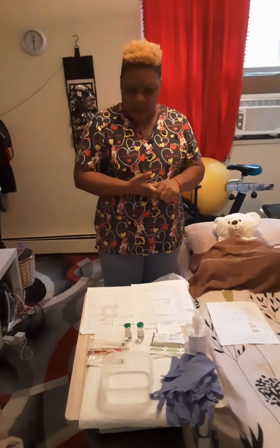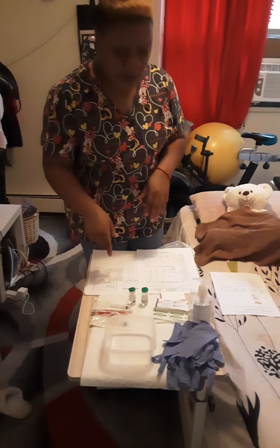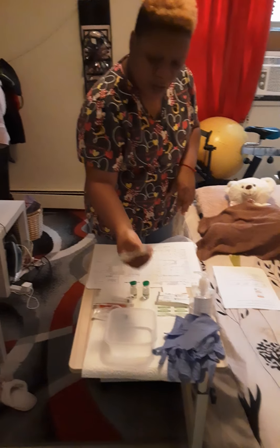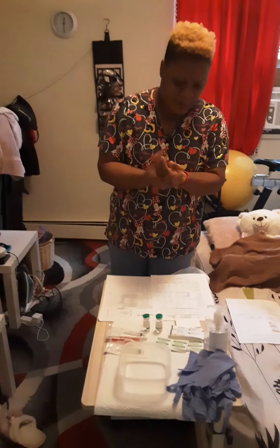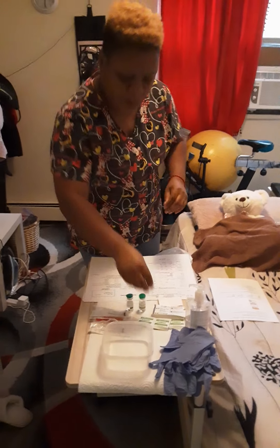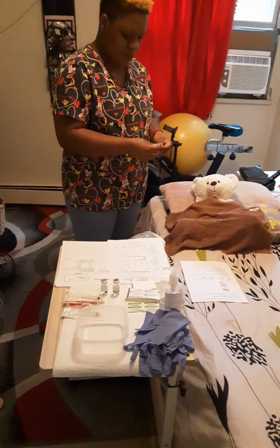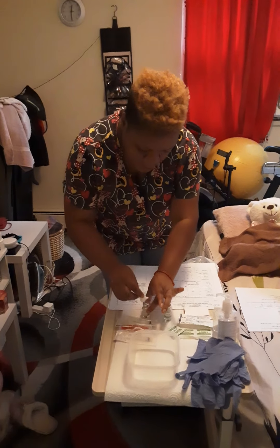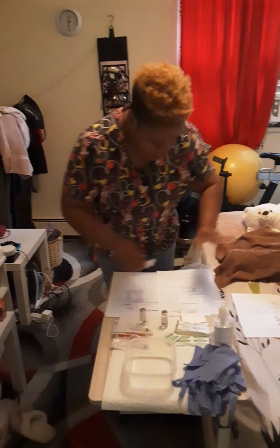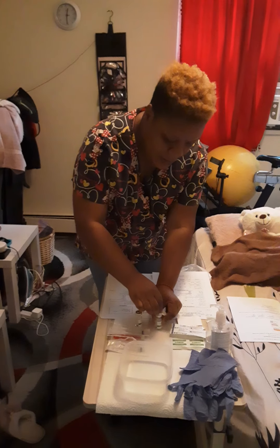The next thing I am going to do is clean the top of the bottles using the alcohol swabs. Before this I will do hand hygiene. I will break the top of the bottles and I will wipe the top of my medication bottle and the diluent that I'm going to use.